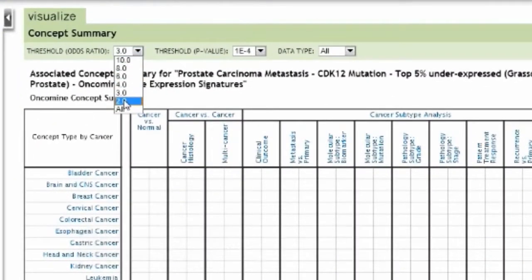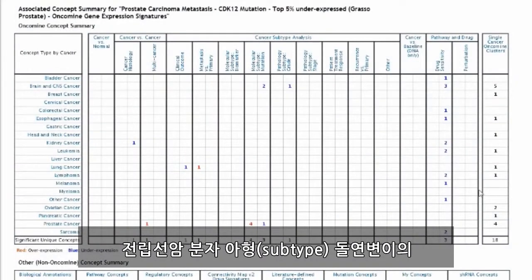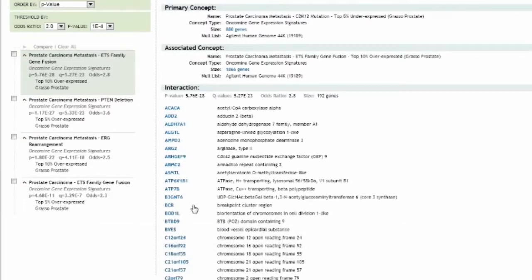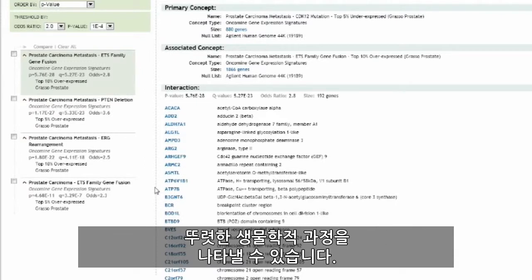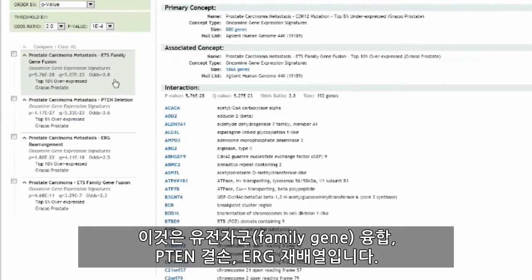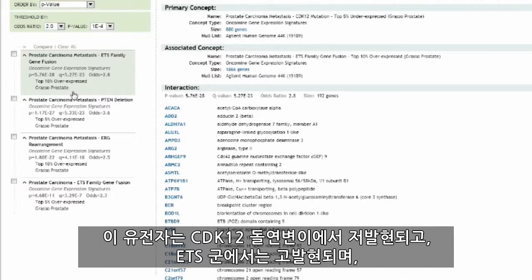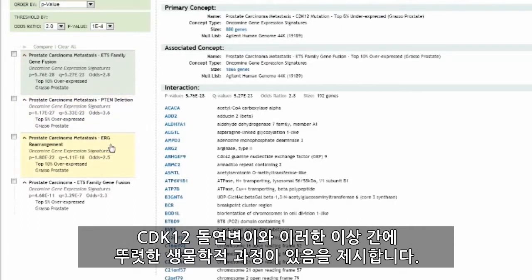Setting our odds ratio to 2, we can now see in our concept summary map four results in prostate cancer molecular subtype mutation. These results are overexpression signatures that share a common set of genes with the underexpressed signatures in CDK12 mutants and may represent distinct biology: ETS family gene fusions, PTEN deletion, and ERG rearrangements. Because these genes are underexpressed in CDK12 mutants and overexpressed in ETS family, PTEN deletion, and ERG rearrangements, this suggests distinct biology between CDK12 mutants and these aberrations.